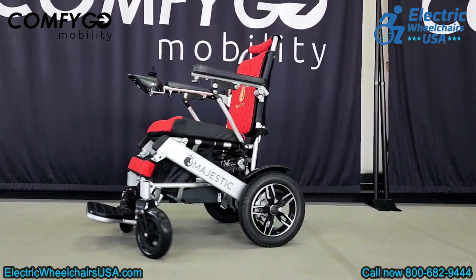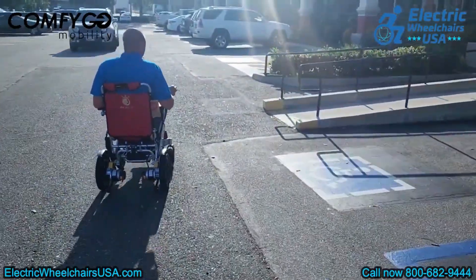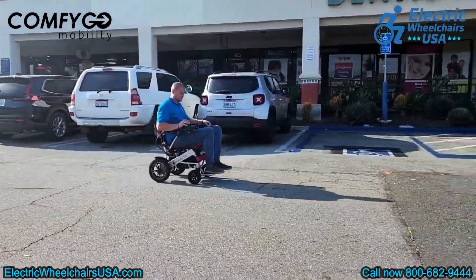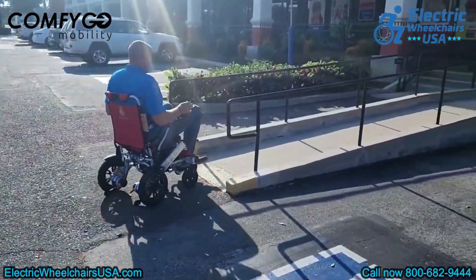To sum up, if you're searching for a folding power wheelchair that's airline approved and supports a higher weight capacity than most, the IQ8000 is a fantastic option. ComfyGo is offering an exclusive 7-day free trial for you to experience their products — a fantastic opportunity to try and see if it's the right fit for your needs.